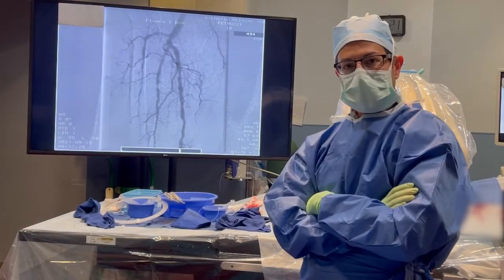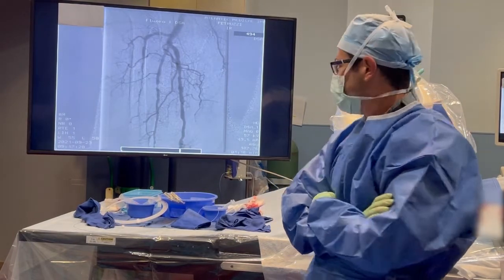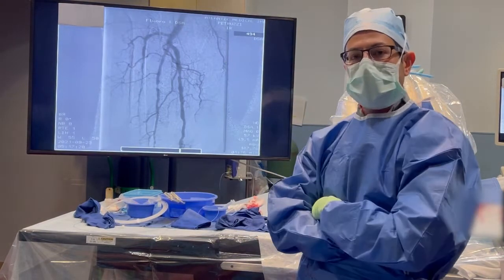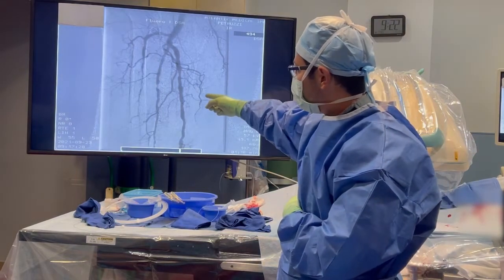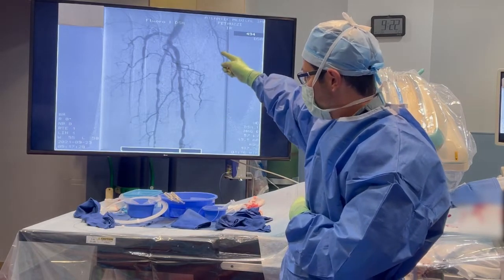This is below the knee on our patient, and we should have 3 tibial vessels, okay? And you see 3 arteries here. If you can see the dark area, that's the X-ray dye that's inside of the artery, showing us the 3 arteries. And if you can appreciate this, on the far left we have a blockage in this anterior tibial artery, which is this one on the far left.